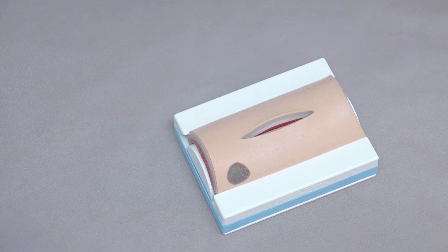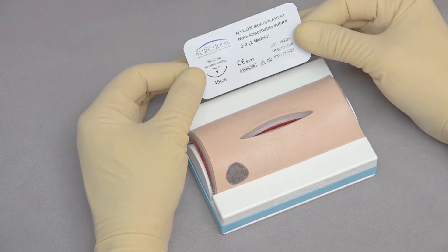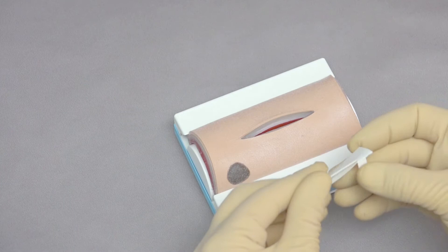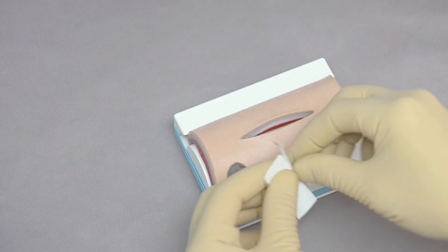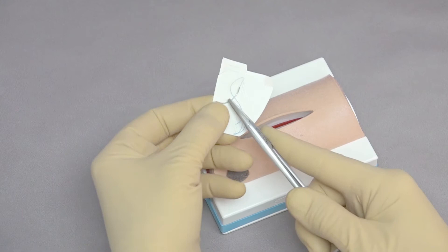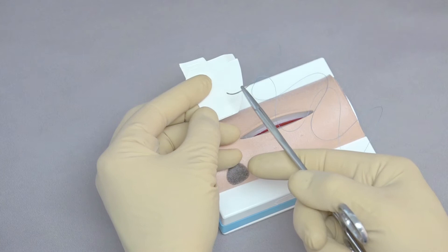We're going to begin by suturing the deep fascial layer. In this case we're using 3-0 monofilament nylon — you would typically use an absorbable suture material for this, but this will give you the experience. Open the packet and identify the needle. The needle is a 3/8 curve, meaning it comes around 3/8 of a circle. Position it so you can grip the needle with the needle holders just behind the halfway point for best use.